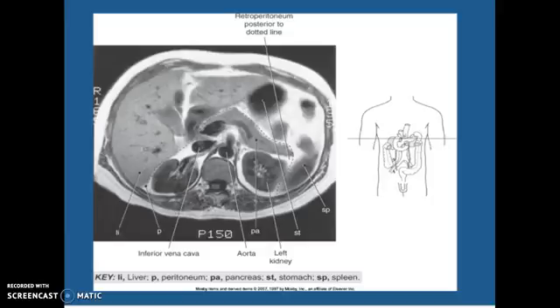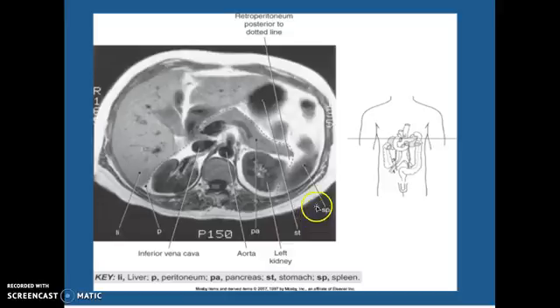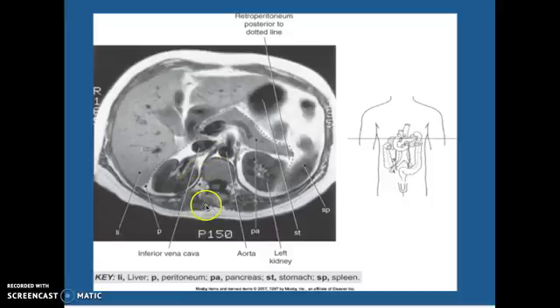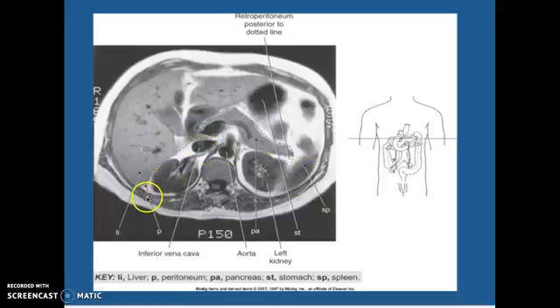Looking at an MRI axial T1, the retroperitoneum is your dotted line there, so everything behind. Your pancreas is in it, your kidneys. Here's your aorta. That line right there is your crus — we talked about the crus with the diaphragm, that's where it comes down and attaches. Spleen, kidney, aorta, this is your inferior vena cava and your peritoneum. This whole thing here is your liver, and this is your gallbladder right there.